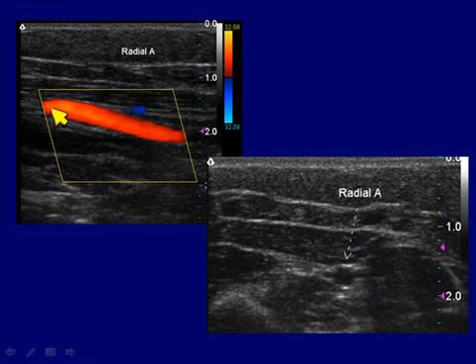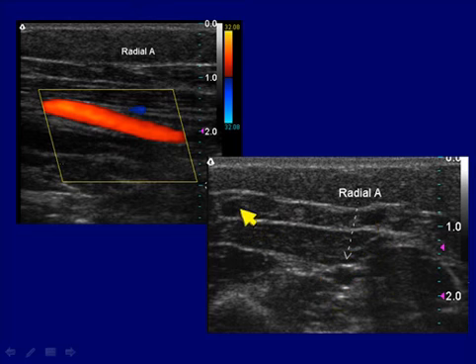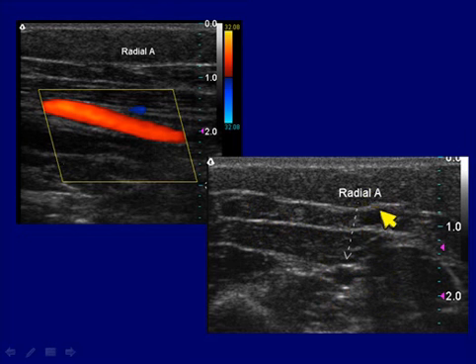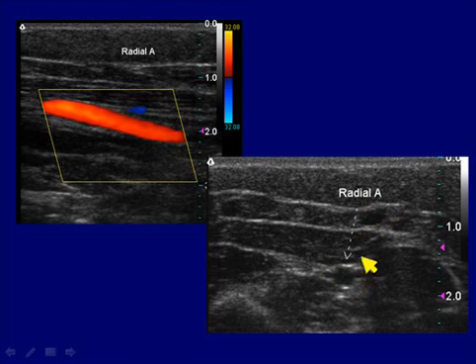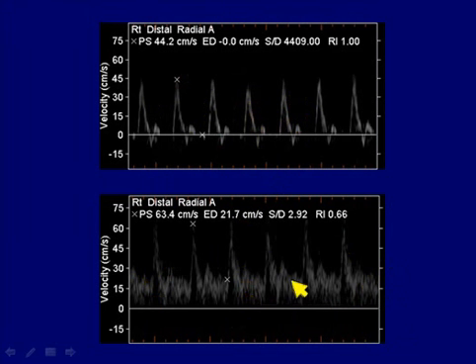Continuing down, we look at both the radial and the ulnar. In the forearm, we have one artery with two small companion veins on either side — those belong to the radial artery. Vessels that are all by themselves without a companion are veins. If those are thrombosed, it's not a thrombosed radial artery — look around, because the radial artery must have its companion veins next door. Use that as your landmark. Again, the radial artery shows a multiphasic high-resistance pattern, except if the patient is hot or vasodilated from drugs — that's still normal.